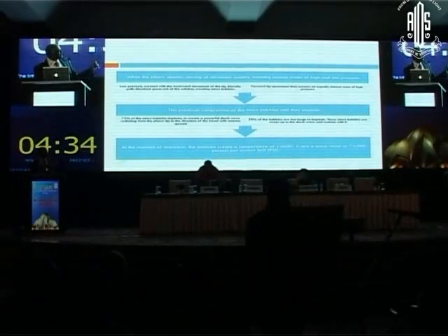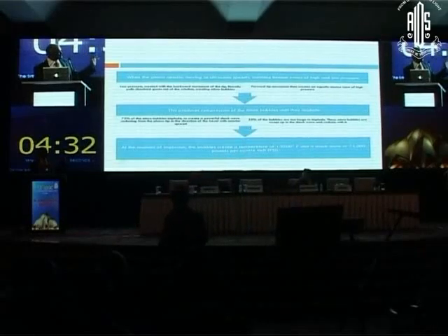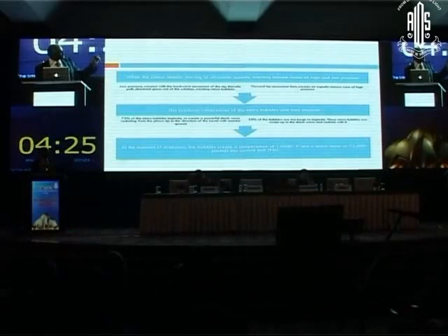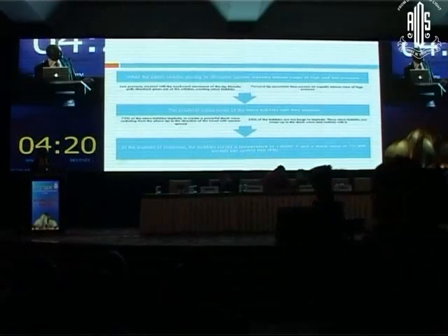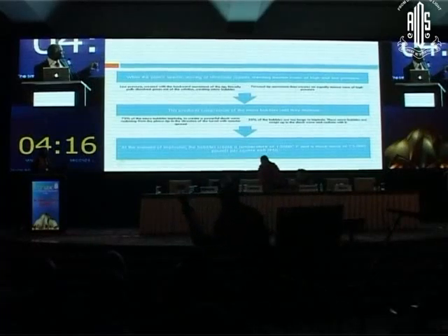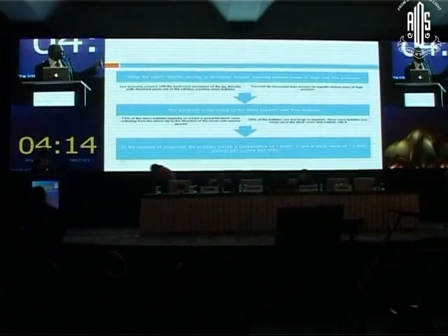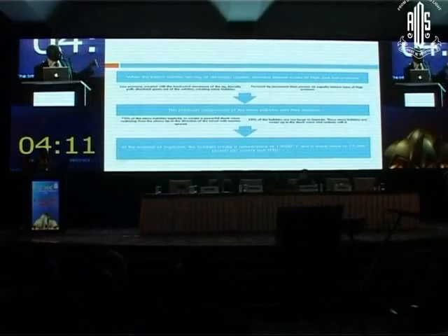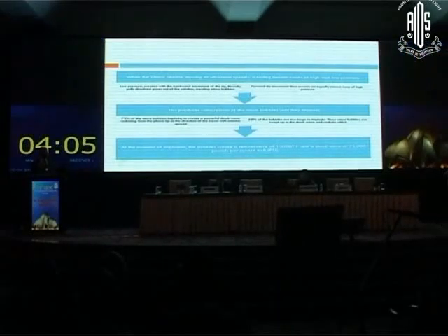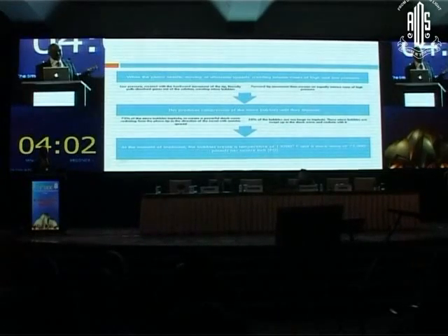And 25% of the bubbles are too large to implode. These bubbles are swept up in the shock wave and radiate with it. Now at the moment of implosion, the bubbles create a temperature, just remember, of 13,000 degrees Fahrenheit. And because of that, though we operate a case, we see the cornea is not damaged.